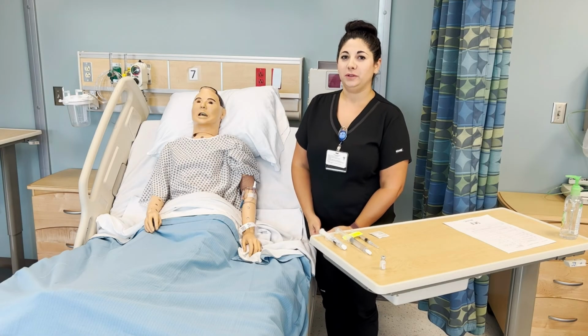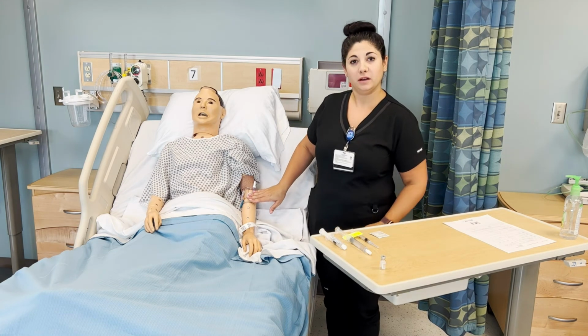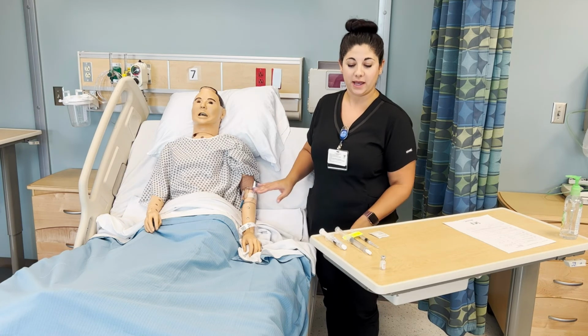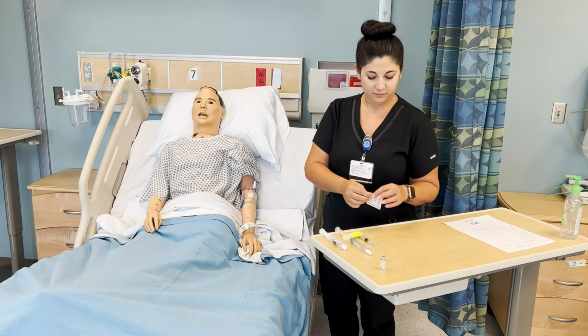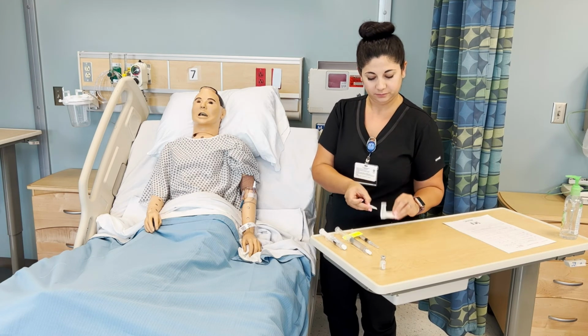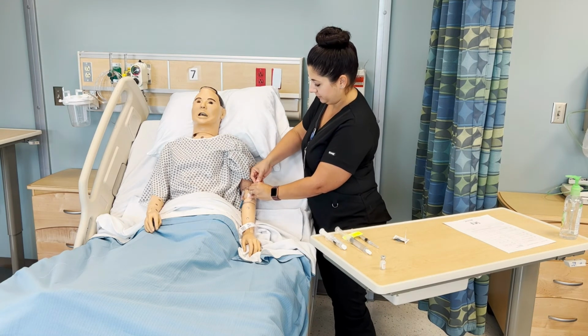This is what you will do if you have no IV fluids running and you just have an IV lock, which can also be called a PRN adapter, a saline lock, or a HEP lock. First, we will clean the port for 15 seconds vigorously.